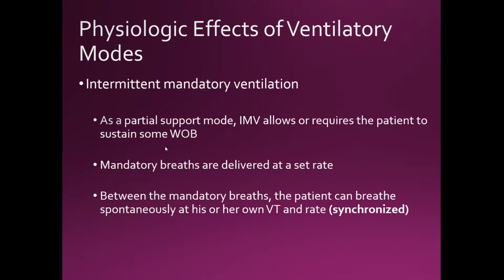If I set the patient on AC and I switch them down to SIMV, then SIMV would be the weaning mode. Capiche? So I don't want you to automatically think SIMV is the weaning mode. No, that would be incorrect. And the reason why people say that SIMV is a weaning mode is because the majority of the times we start the patient on CMV, or should I say assist control.